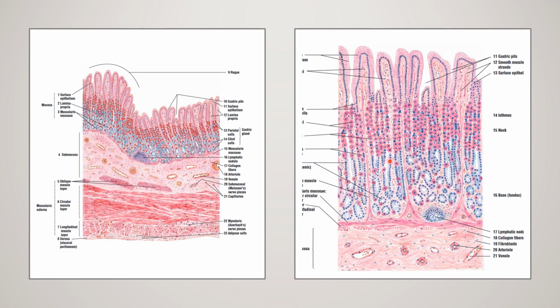Next, if you go down to the lower part of that gland, you have hematoxylin stained cells. These cells are called chief cells, or zymogenic cells. That also you already studied in physiology. It secretes pepsinogen, which gets converted into pepsin. So in the lower part of the gland you have hematoxylin stained cells, the chief cells. In the upper part of the gland you are having more of parietal cells.